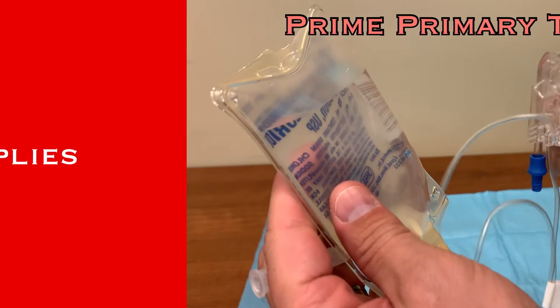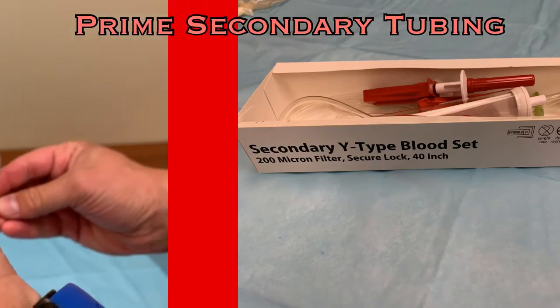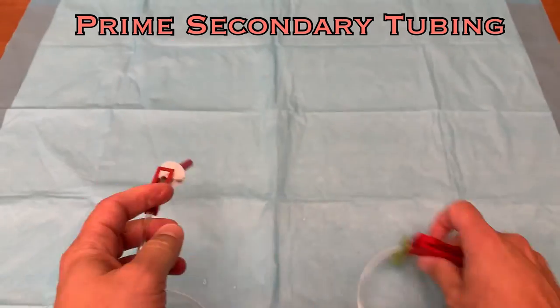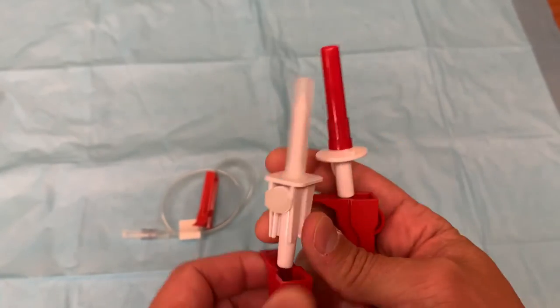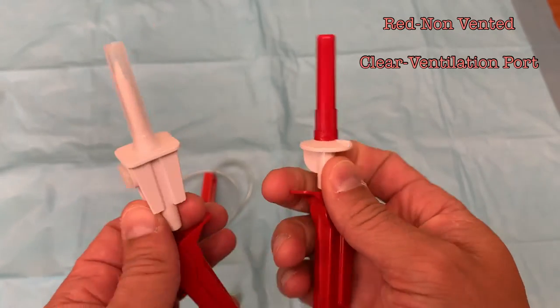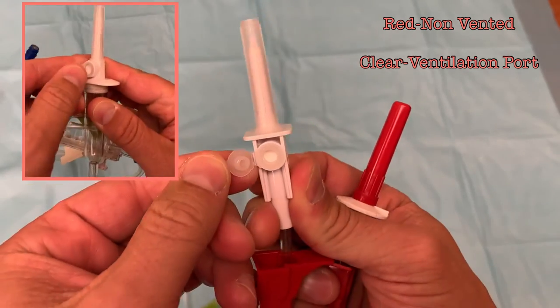Next, set up the tubing for the transfusion. With one of the saline bags, prime the primary tubing, then move to the secondary tubing. Before you begin, close all three roller clamps. There are two spikes on this tubing set — one has a red cap and the other a clear cap. The red cap covers the non-vented spike, and the clear has a ventilation port attached, identical to those found on the regular tubing sets.